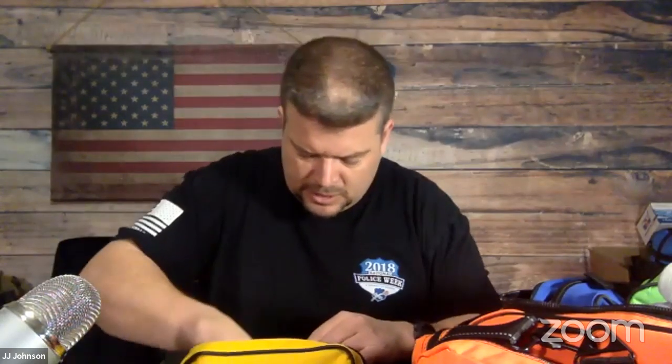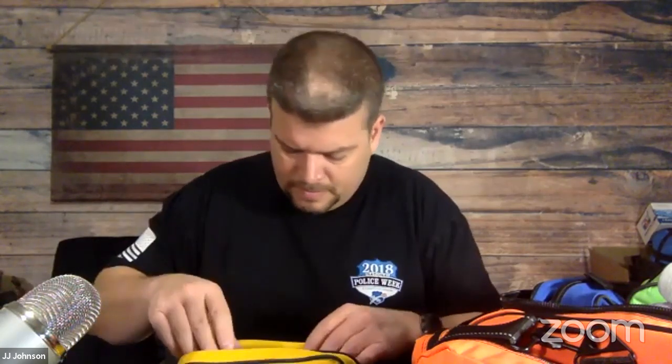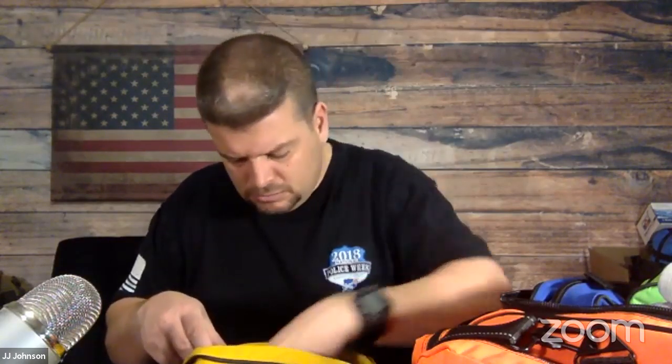Wet ones, baby wipes, antibacterial, a little flashlight, a Rayovac flashlight, that's what that battery was too. Some more good tweezers, little sharp tweezers. And pocket knife. About done. A whistle. And surgical blades. Another set of forceps. That's pretty much it. Okay, so that's a disaster now. I got a lot of stuff to clean up.